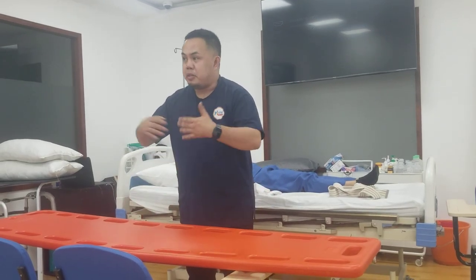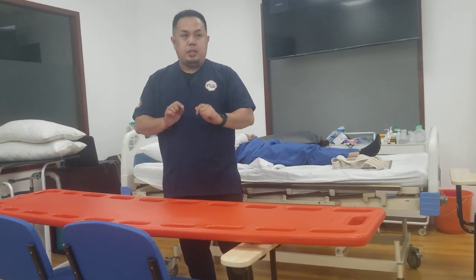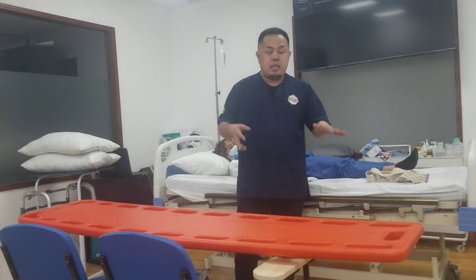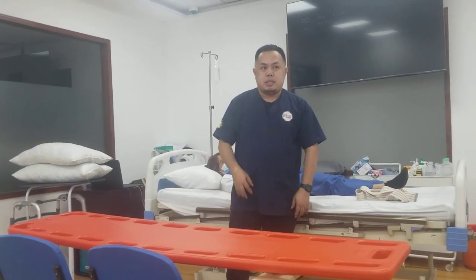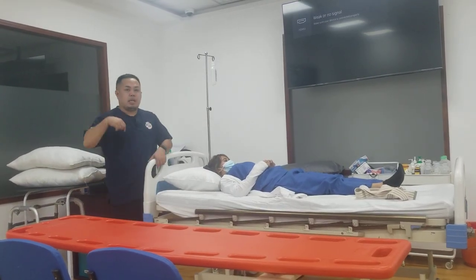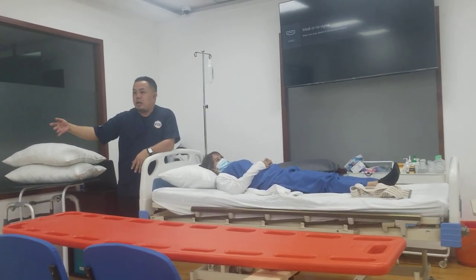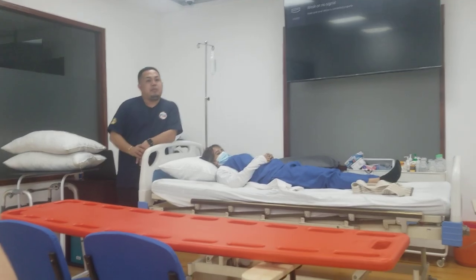That's the stretcher bed, and on top of the stretcher bed is the board. Use your imagination — I'm not changing the principles, I'm just doing some revisions based on equipment availability. Let's do your opening: check the chart, get written instructions and the doctor's order, then do your hand washing, then tap your colleague and tell them: 'Please go with me.'